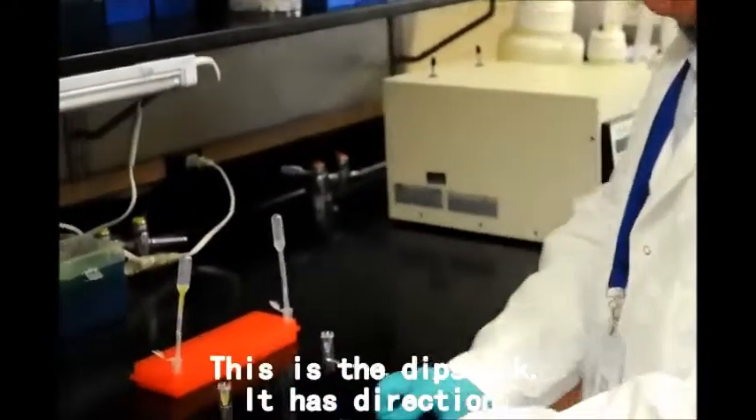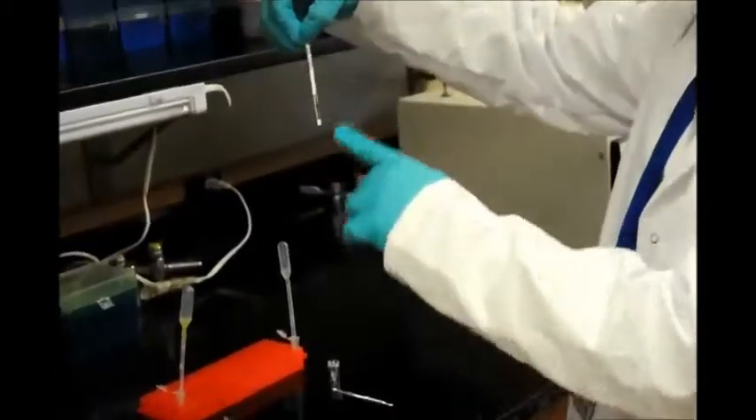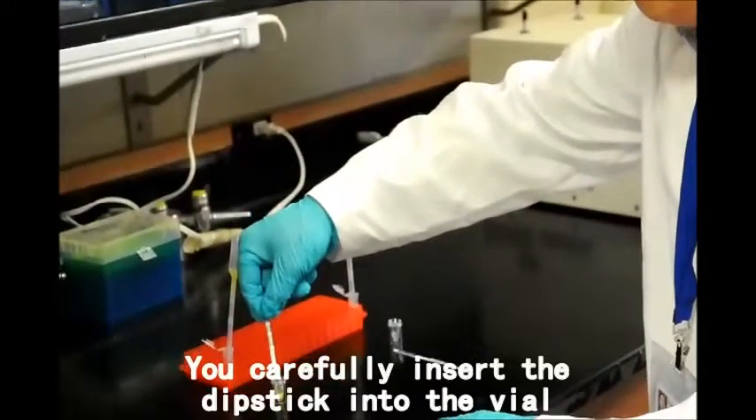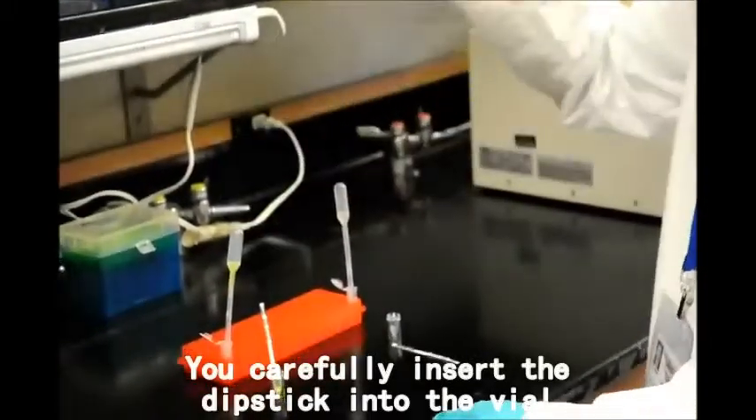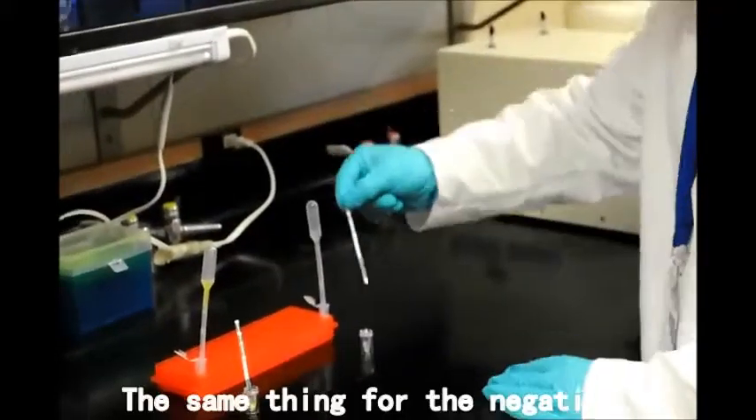This is the dipstick. It has a direction indicated by an arrow that should be pointed down. You carefully insert the dipstick into the vial, and do the same thing for the negative sample.